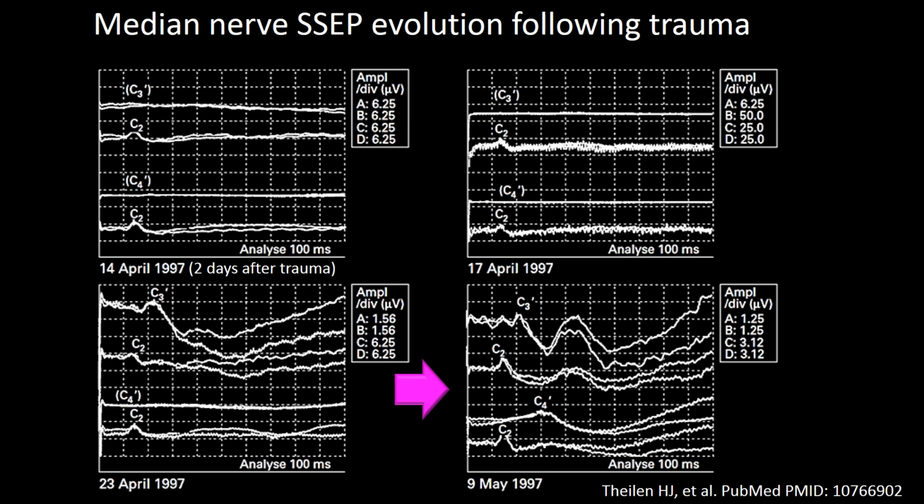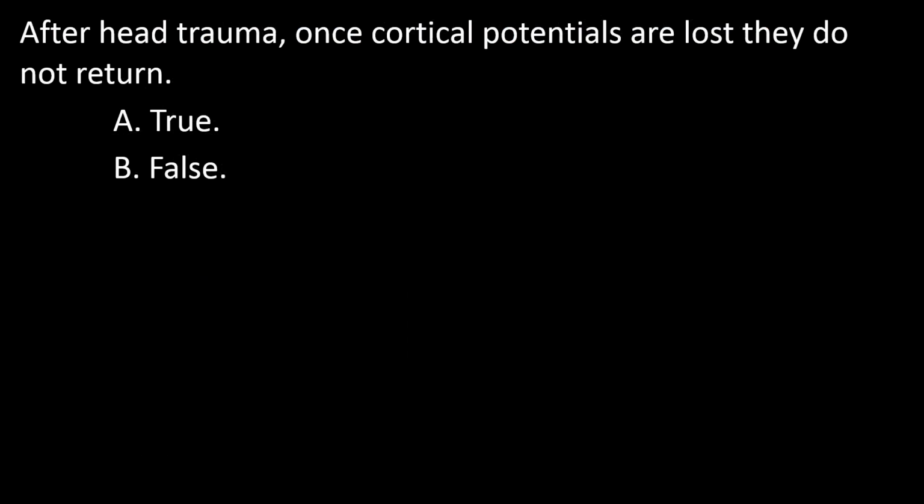Now comes 4 weeks after, and as you can see, the cortical potentials are present. So the answer to this question is B.